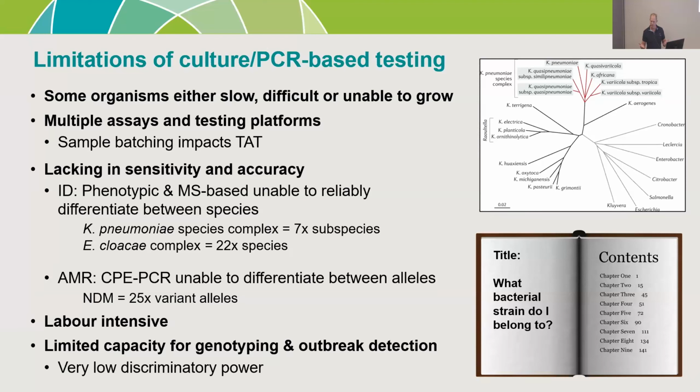A lot of our methods are labor intensive. They are what they are. They're culture-based methods. And on top of this, for a long time, we haven't really had a good way of genotyping organisms in Pathology Queensland.